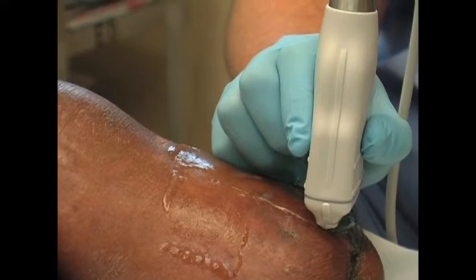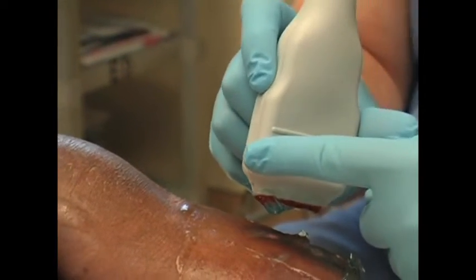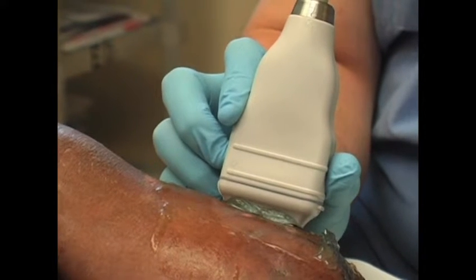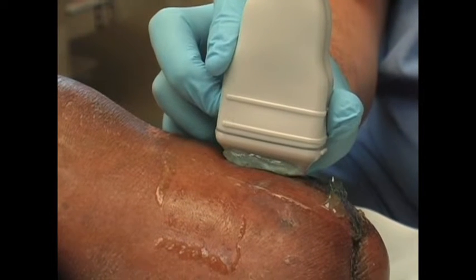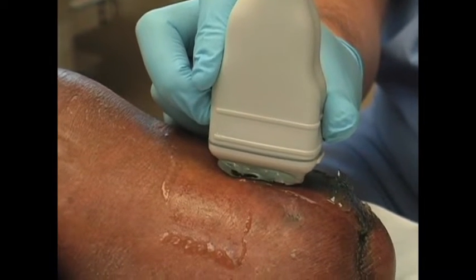Once he's scanned all the way down in the transverse plane, he'll turn the transducer with the indicator up towards the head in the sagittal plane. And now he's going to scan from left to right all the way through the affected area. Once again, we're looking for any discrete pockets of fluid that we might be able to identify.